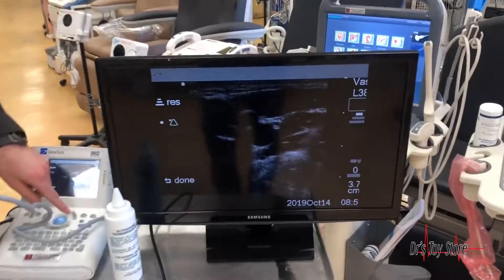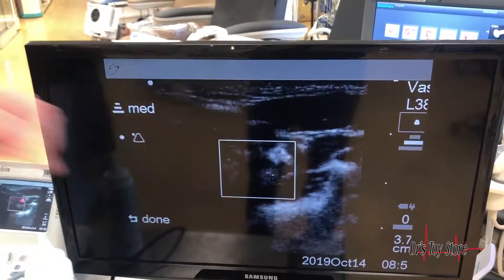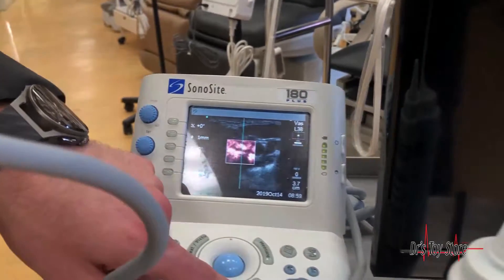Now look at this picture — you can actually see very, very nicely. You might need a color monitor, but you can see the color Doppler in here very, very well.